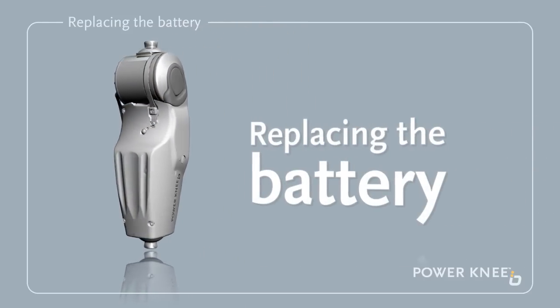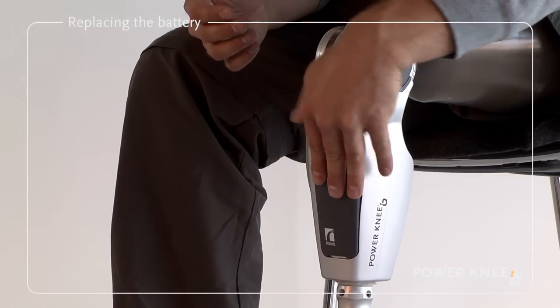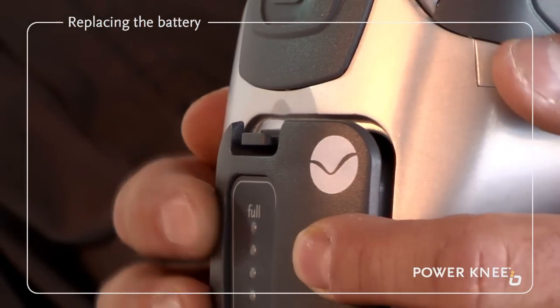Replacing the battery. Push the newly charged battery into place until a click is heard.